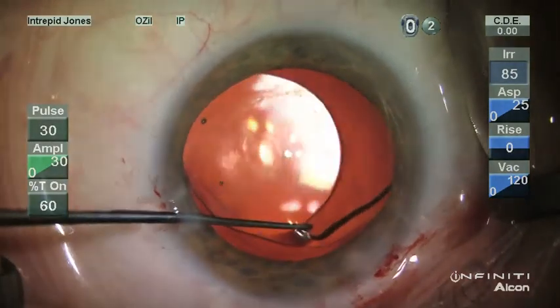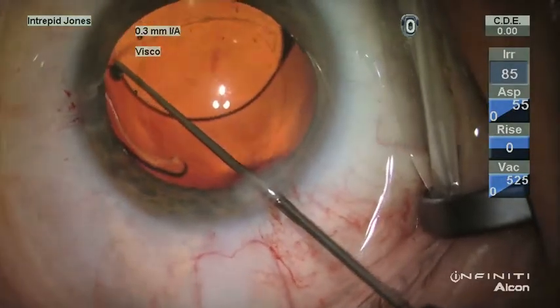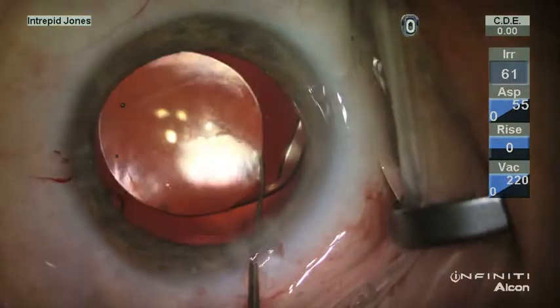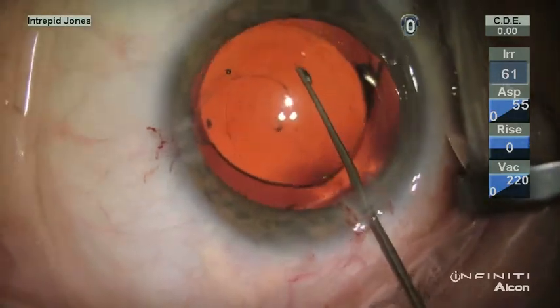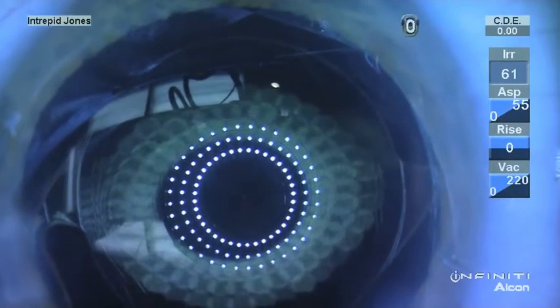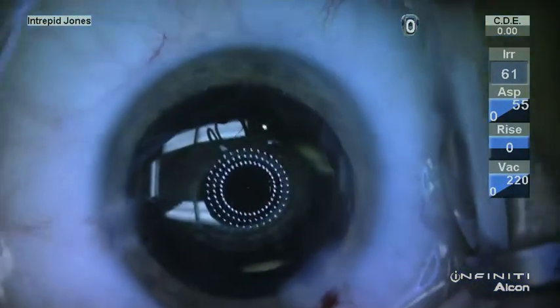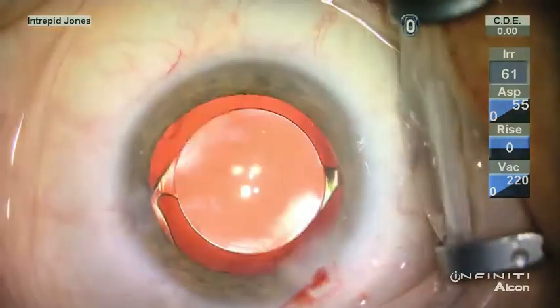With careful visco-dissection and blunt dissection with traction, the lens was freed, then rotated 360 degrees, with its final position confirmed using the fixation light and concentric alignment of the keratoscopic view. This patient had an excellent outcome and stable recovery.